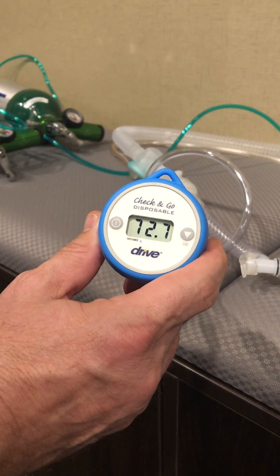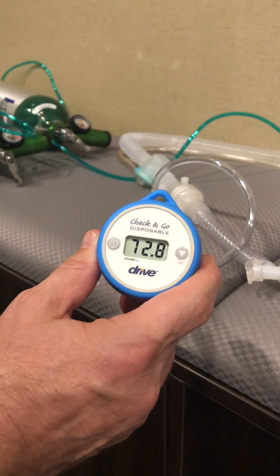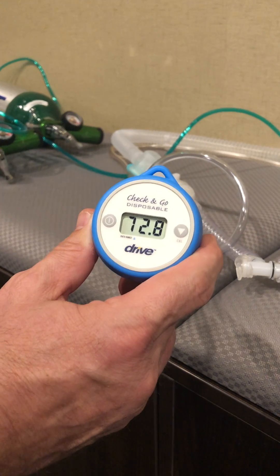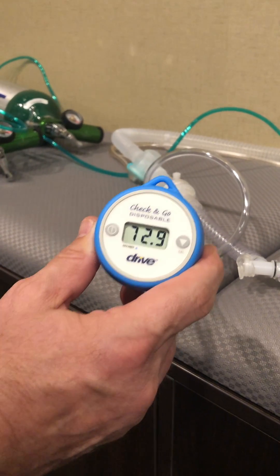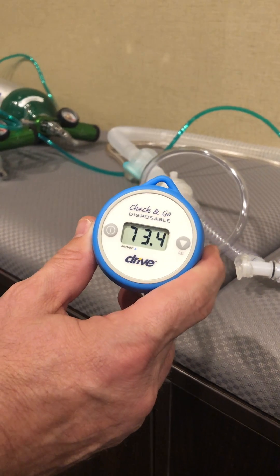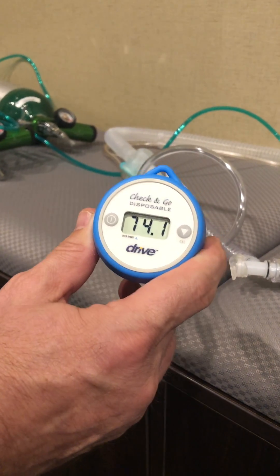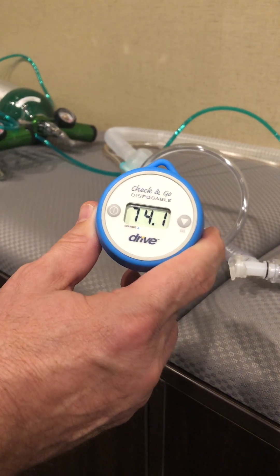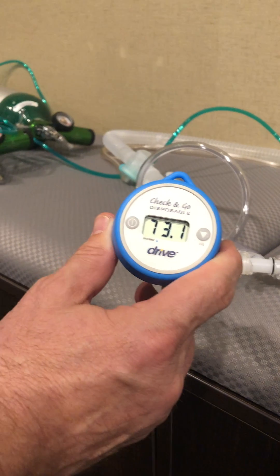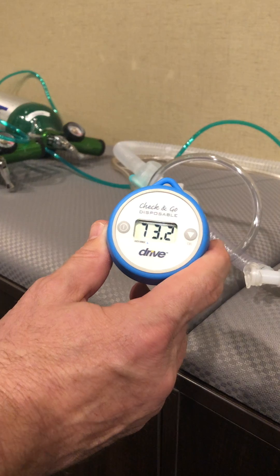A facility flow meter typically runs at around 15 liters — of course you can flush that to get more oxygen. But based on all the demonstrations and tests we have run, we think this is a reasonable expectation of FiO2 for the patient. This is a high oxygen demand scenario, so we're not at 100% — we don't think that's a reasonable expectation. We do think between 65 and 75% is practical and reasonable in this situation.